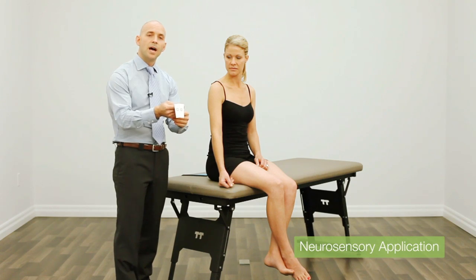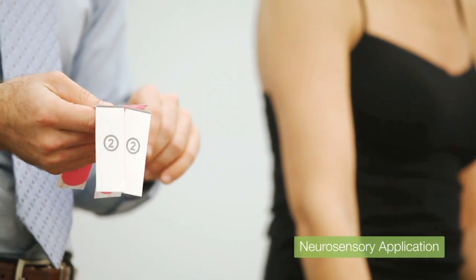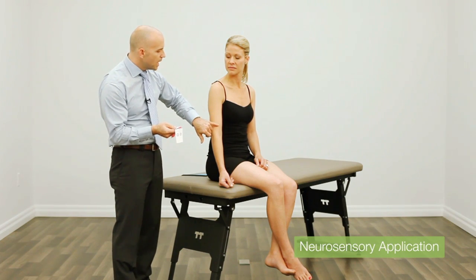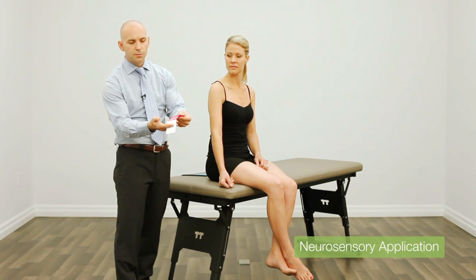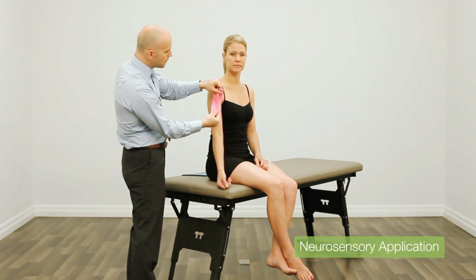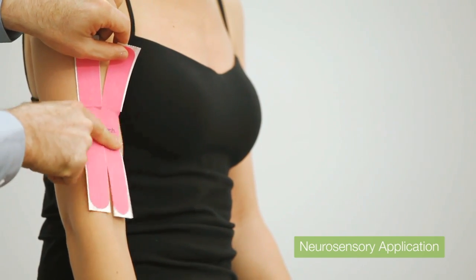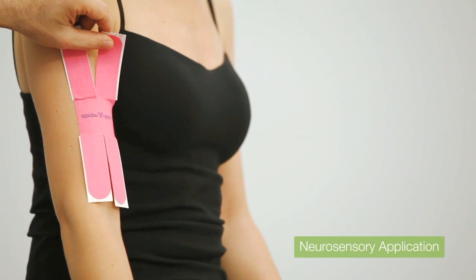The principles for applying neurosensory applications are that I'm going to be stretching the tissue and not the tape. Even though the tape is flexible, I'm going to not stretch it when I apply it to the skin. For example, if we had a strain within the bicep, I would take the backing, remove the tape to expose the adhesive, then place it over top of the area — in this case, the bicep area. I would apply that first portion without any stretch, in a comfortable and relaxed position.